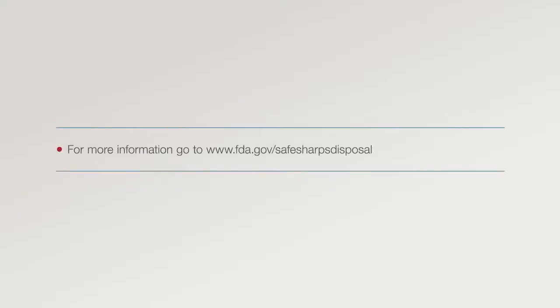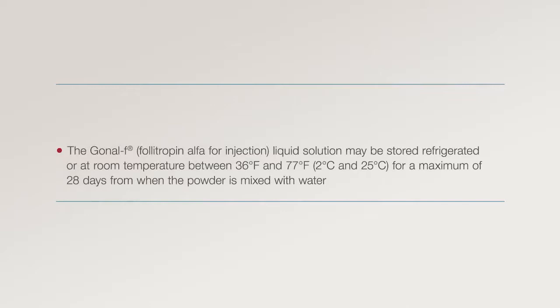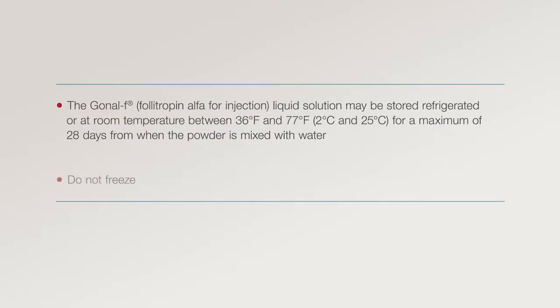For more information, go to www.fda.gov/safesharpsdisposal. Step 5. Storage. The Gonal-F liquid solution may be stored refrigerated or at room temperature between 36 and 77 degrees Fahrenheit for a maximum of 28 days from when the powder is mixed with water. Do not freeze. Discard unused liquid solution after 28 days.